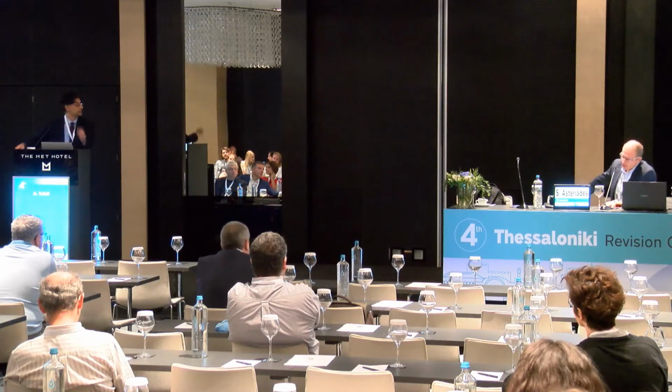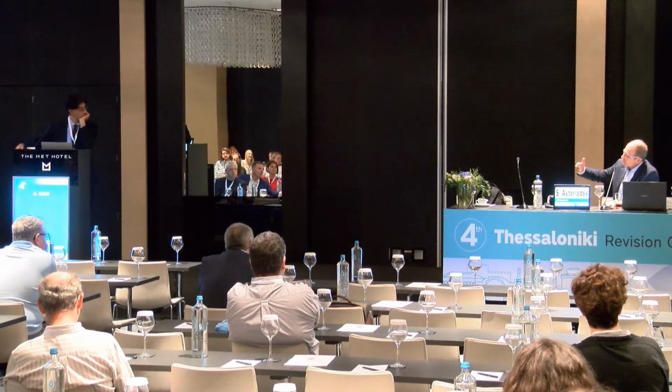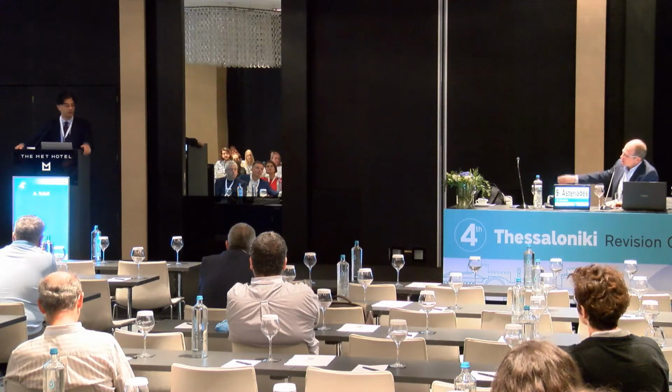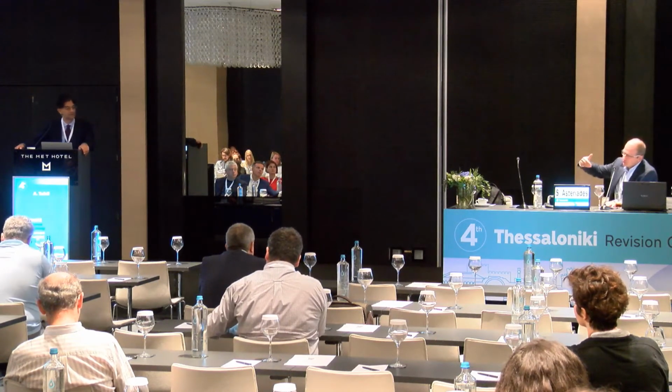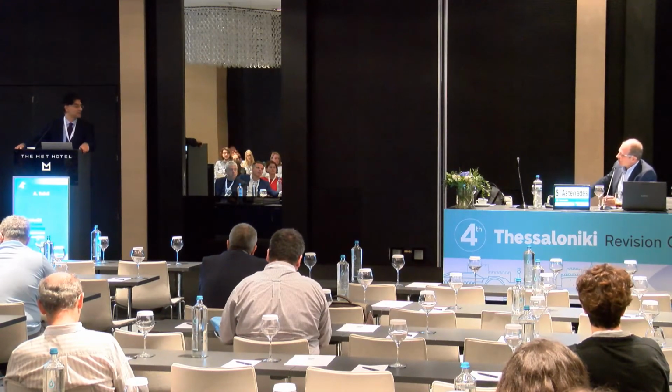Talking about polyps, can you give us some insight or your views on the trials to sort of classify the different varieties of polyps? So secondary or primary or related to CNV or others?